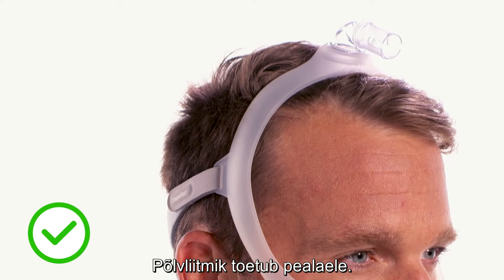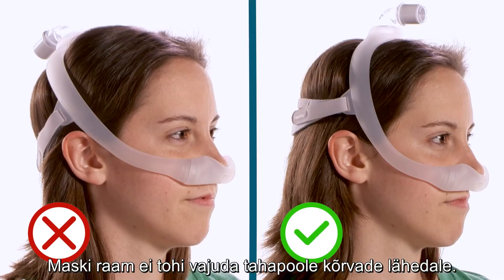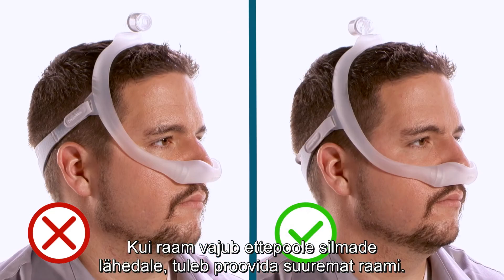The elbow will be positioned at the top of the head. The mask frame should not fall back close to the ears — if it does, try a smaller frame. If the frame falls forward close to the eyes, try a larger frame.